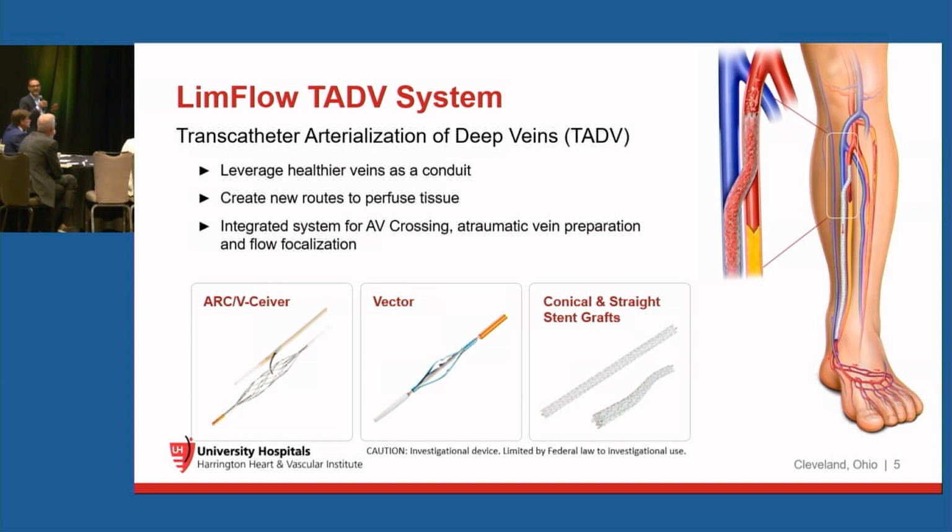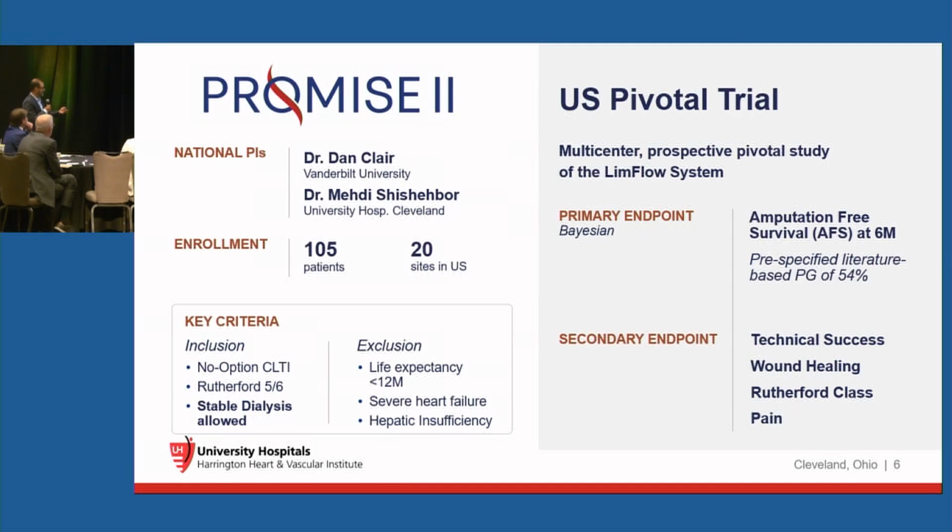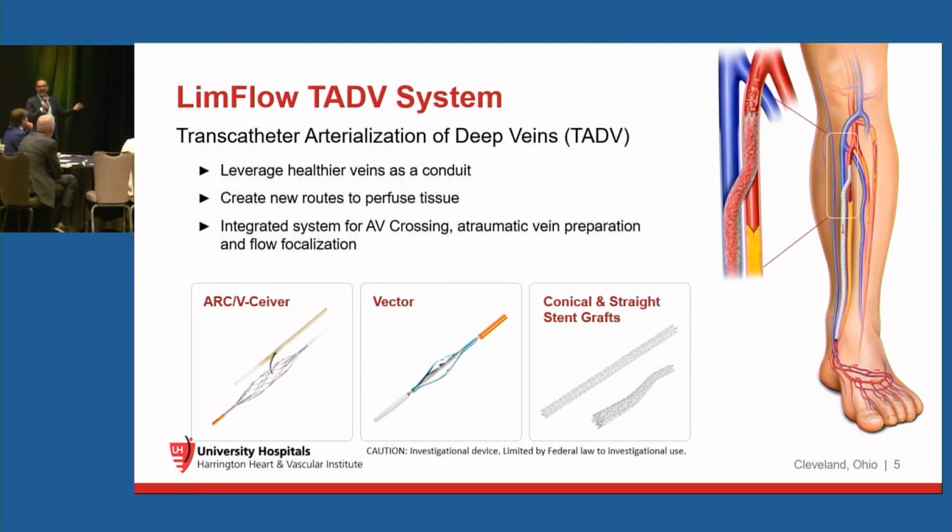Well, the veins have the valves, and that was one of the limitations of the early surgical data, which we used to do 100 years ago with this DVA that we used to create, is that we didn't destroy those valves. And this vector deals with those valves in the veins and destroys the valve.